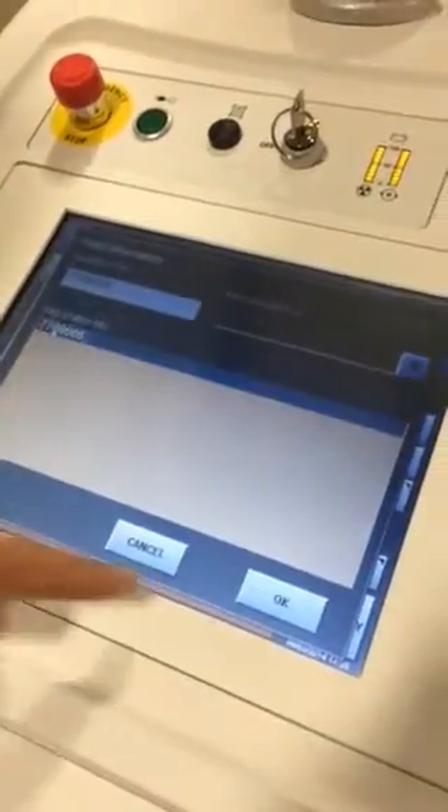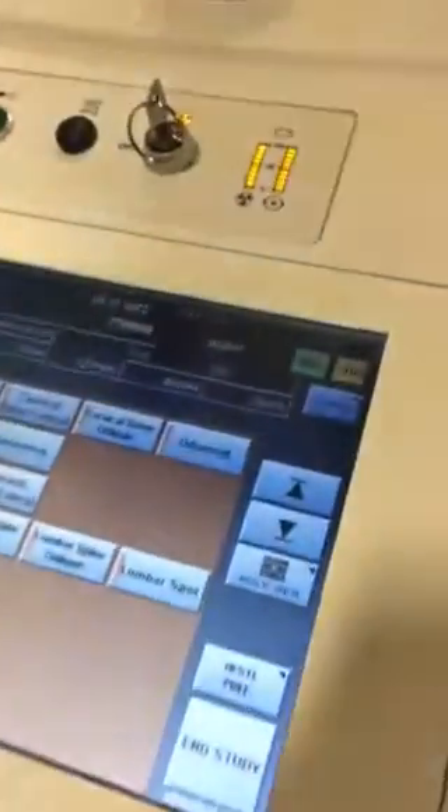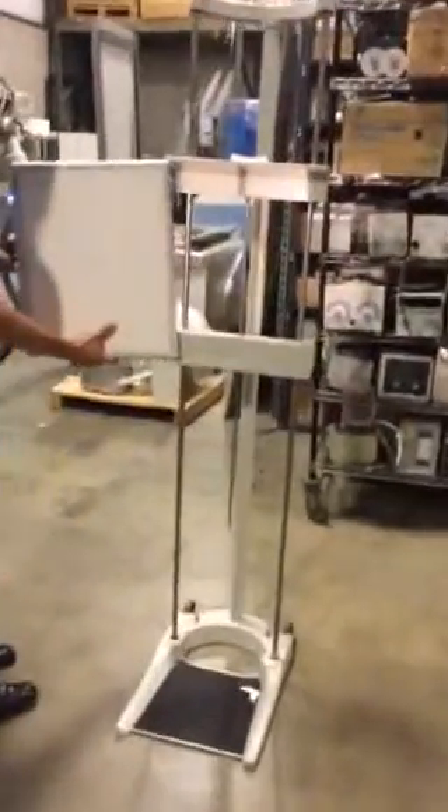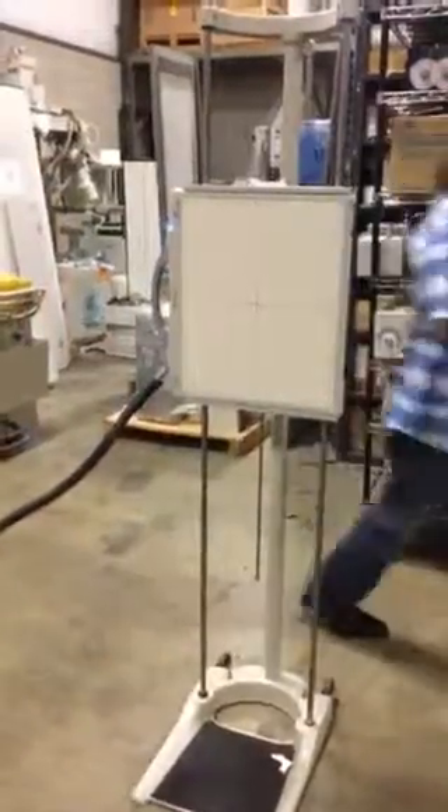It wants a registration number and it's ready to go. So now you get it ready. I'm going to take the detector and put the detector in the upright. We'll wheel this over.